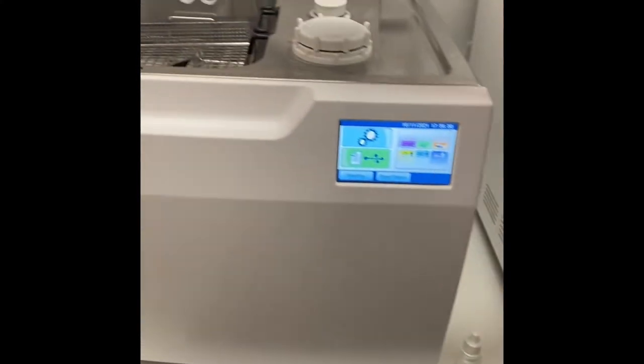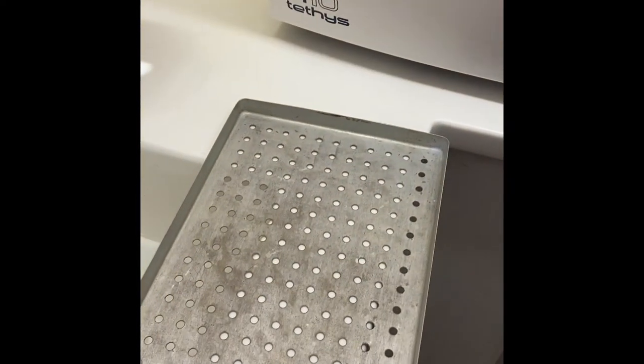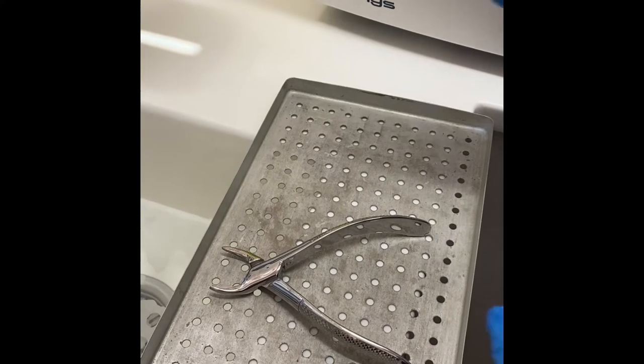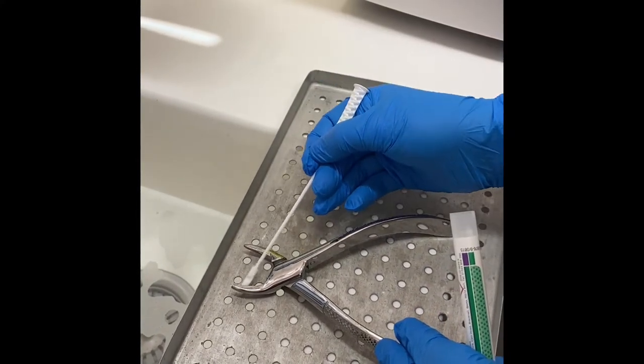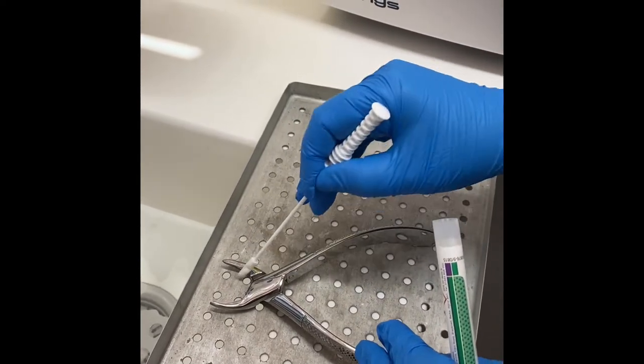Remove the instruments after they've been through the wash disinfector cycle. Pop the instrument onto a tray, take the swab, and now thoroughly remove the swab around the instrument, making sure it goes into all the little nooks and crannies and hinges.